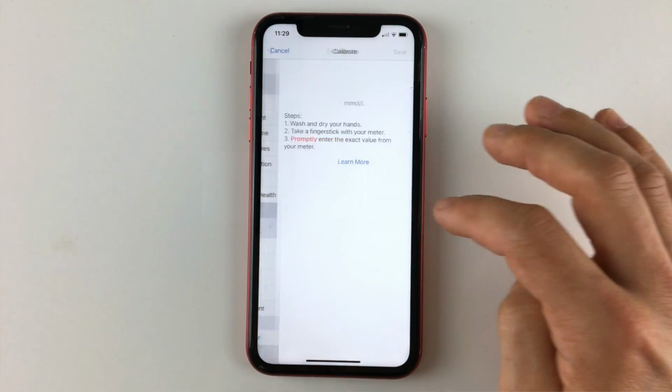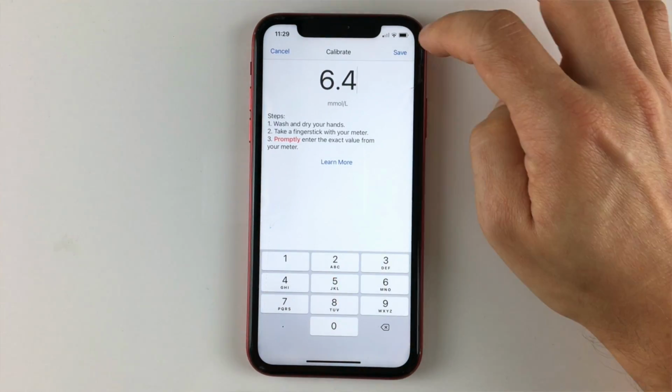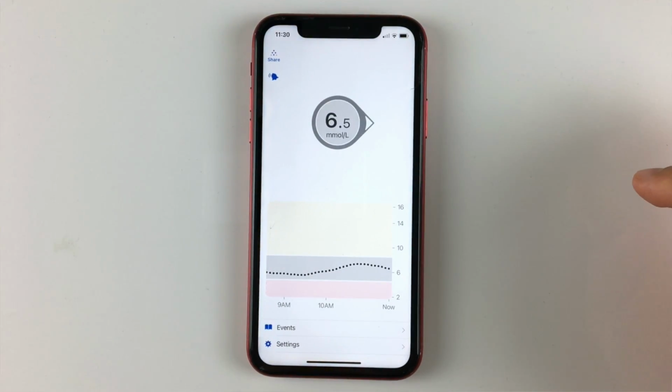Another advantage of Dexcom when it comes to accuracy is that Dexcom typically lets you calibrate the sensor readings right within the native app, and I don't expect this to be different with the G7. FreeStyle Libre 3, including the early drop of the third generation, doesn't let you do that. So when your sensor is not accurate, you just have to send it back.